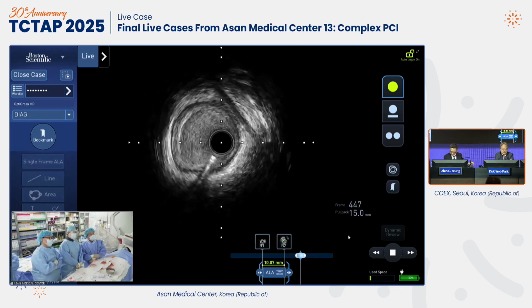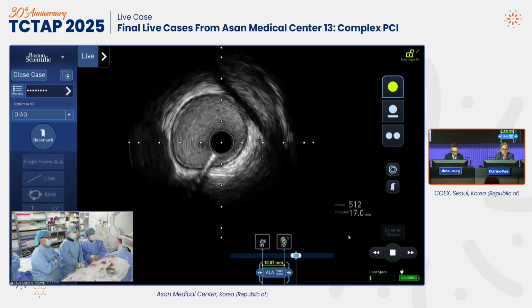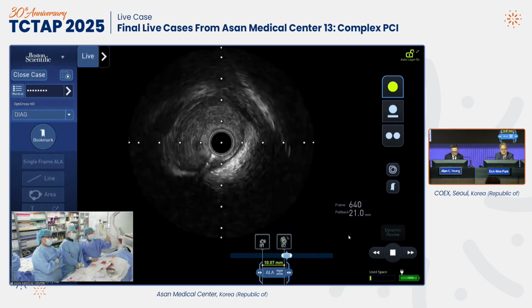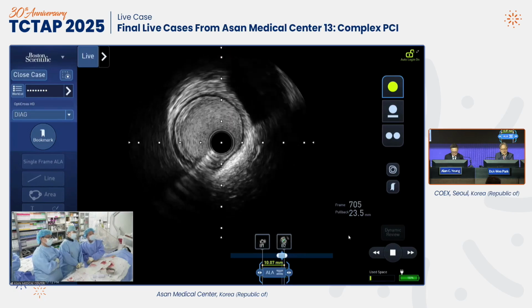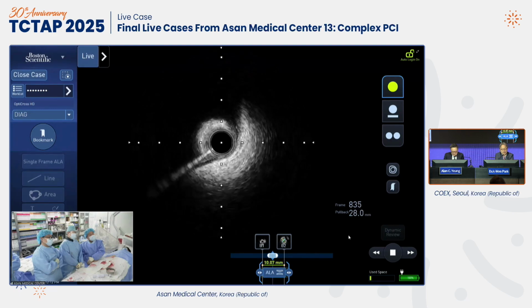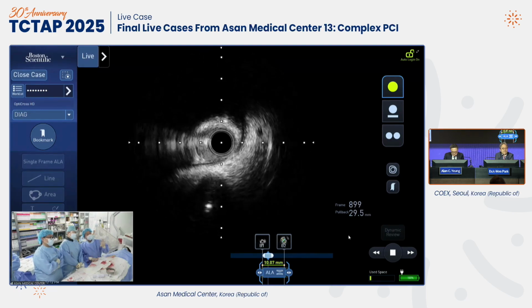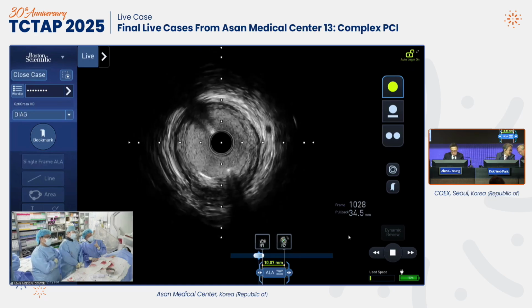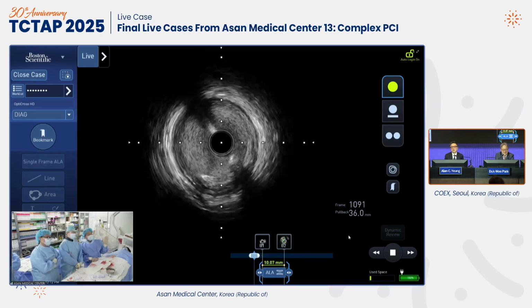This diagonal? Yeah. Great. 3.0. Big vessel. Even more than 3, more than 3. Yes. Wow. Plaque starts, wow, very very tight. Yep. Oh, yeah, pretty much plaque. Very tight stenosis. And the joint with the LAD, take them at 6 o'clock. Yeah. Absolutely normal.